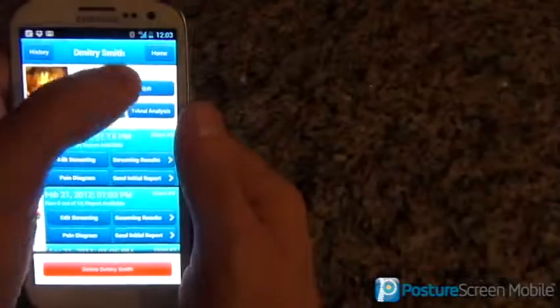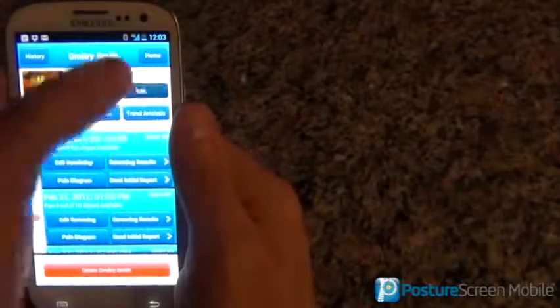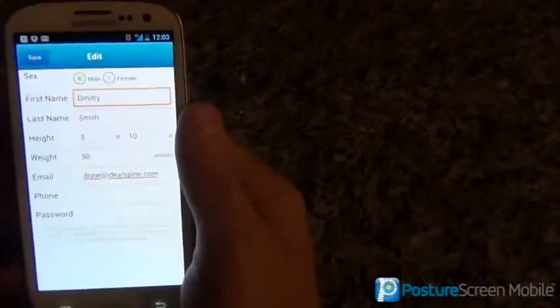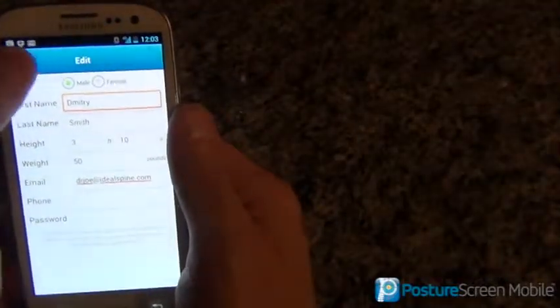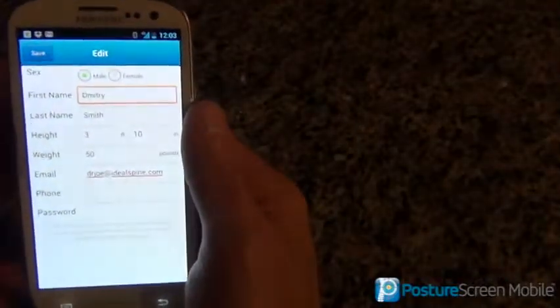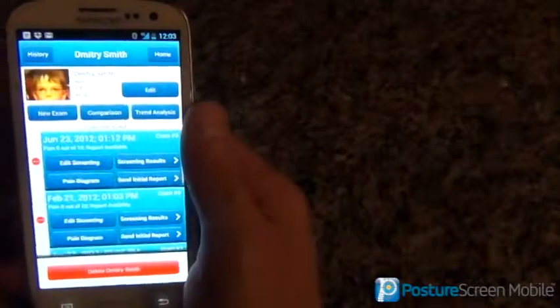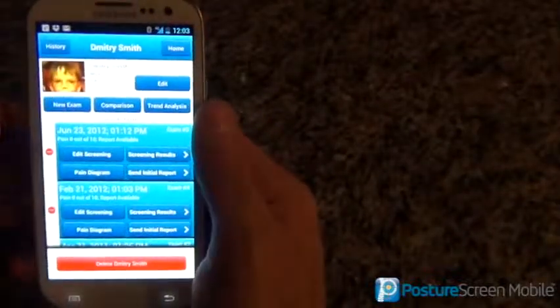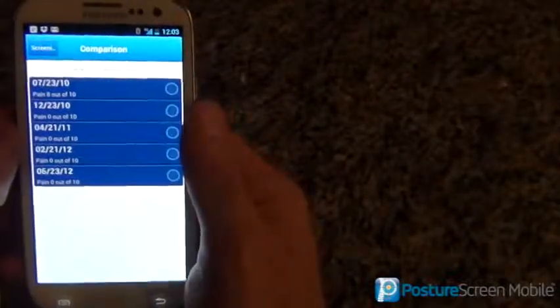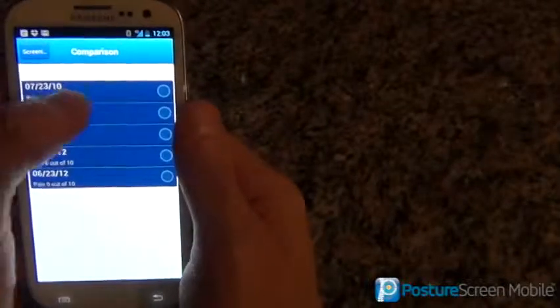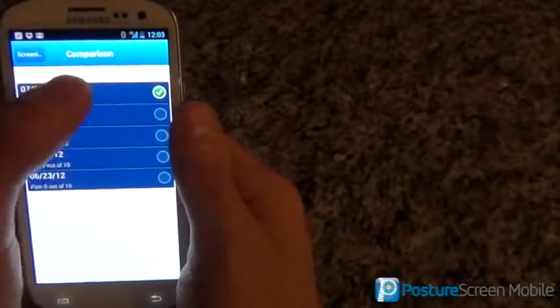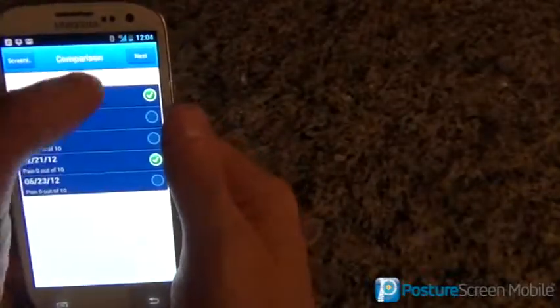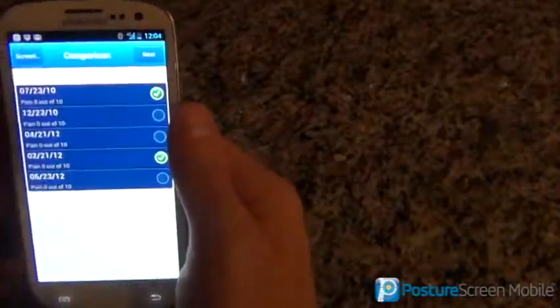If there's any problems — I didn't cover this before — we just hit Edit and we can change whatever we need to there. So to do a comparison, all I have to do is hit Comparison, choose two dates of service. Let's go ahead and choose these two dates and hit Next.